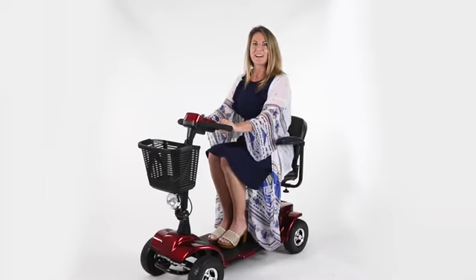Hi, I'm Lisa, sales rep here at Vive Health. Today, I wanted to introduce you to our Series A 4-wheel mobility scooter.